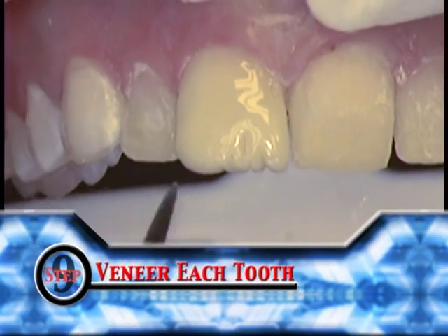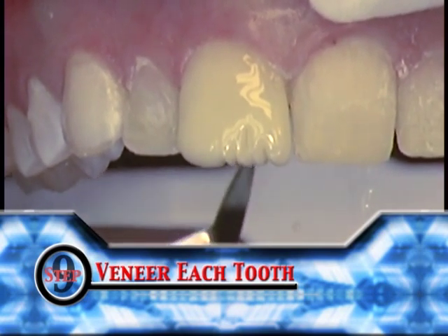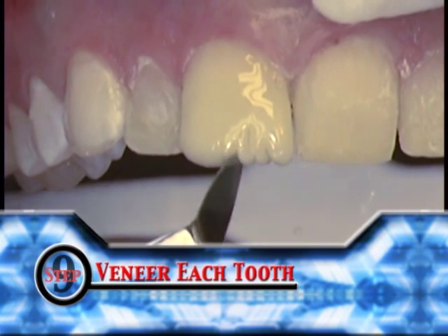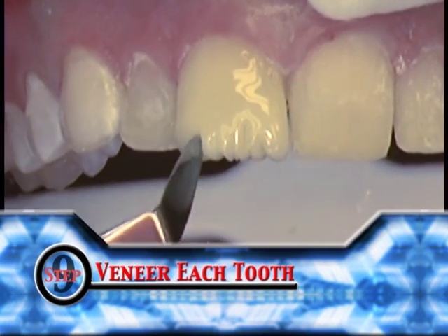After Venus has been shaped, our doctor creates mamelon lobes with the edge of his instrument in order to create translucency at the incisal edge. There is no set pattern. The more lobes created, the greater the translucency.